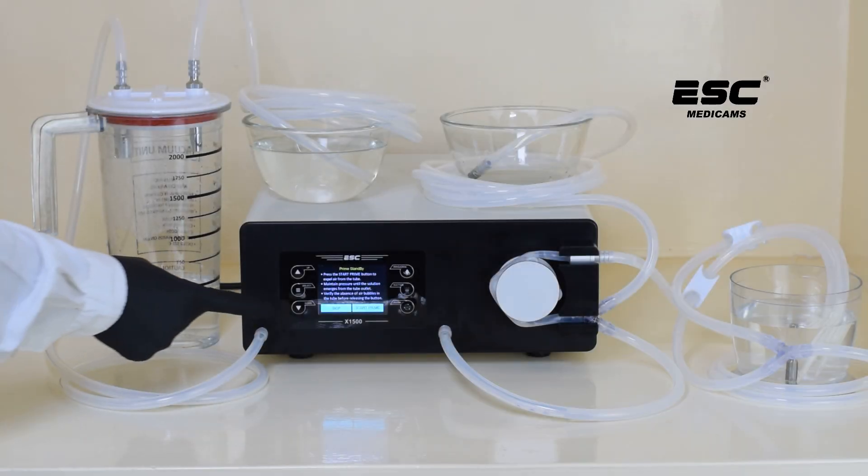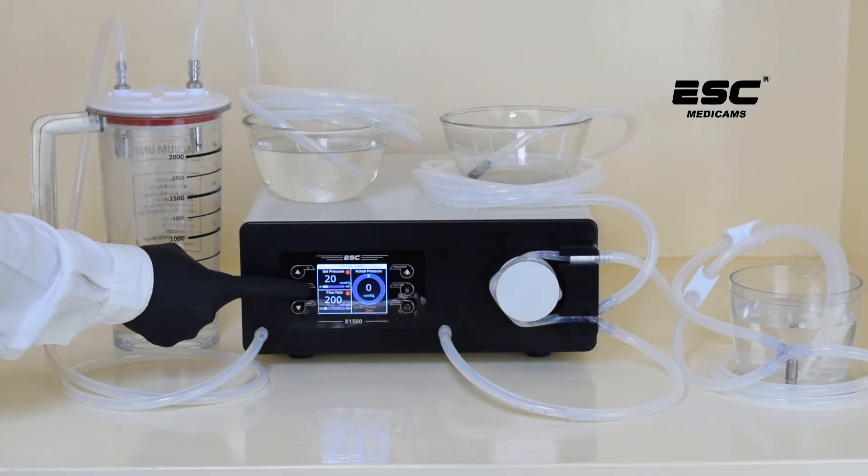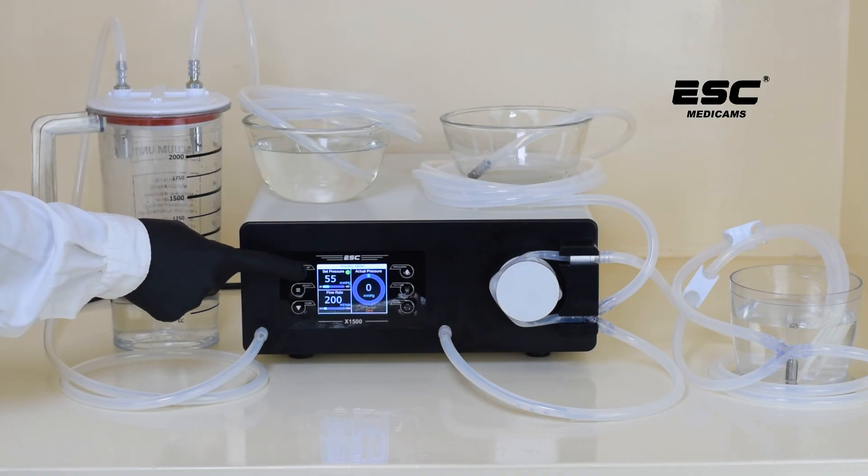Switch on the unit and skip the instruction by pressing the down button. Press the select button and a green dot will appear on the set pressure option. Adjust the pressure according to your requirement.